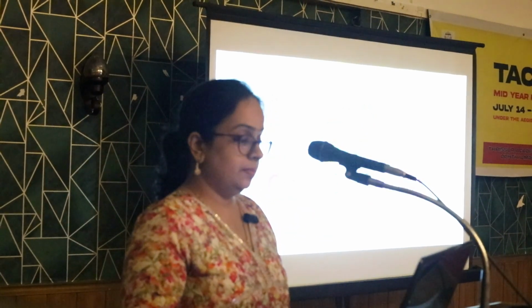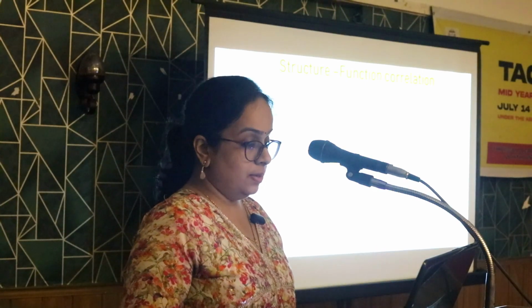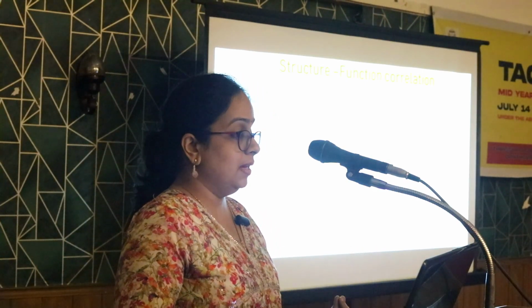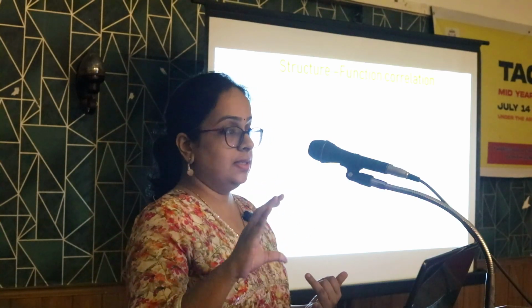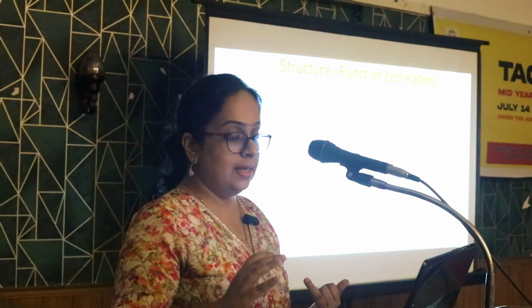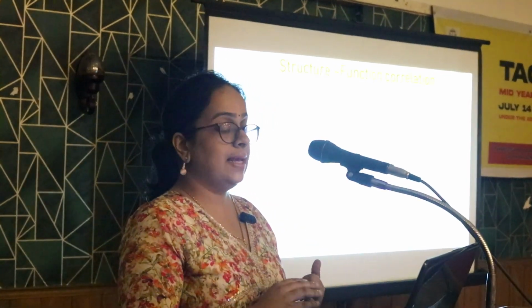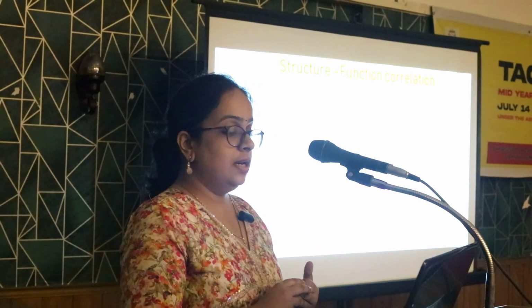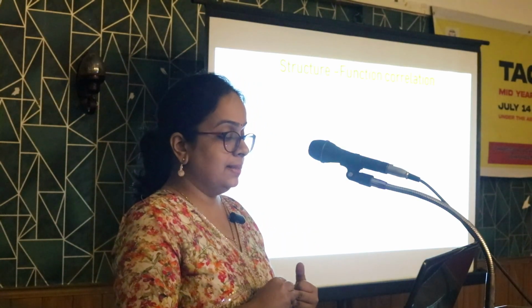So although the structure-function relationship is related to the loss of ganglion cells, it can be variable and imperfect because of the variability of the test and measurement of the structure. RNFL defect is measured linearly and the visual function is measured on the decibel scale. So there is a measurement scale difference, there can be some inter-individual physiological variation, and there can be a lack of precise co-localization between the measurements.